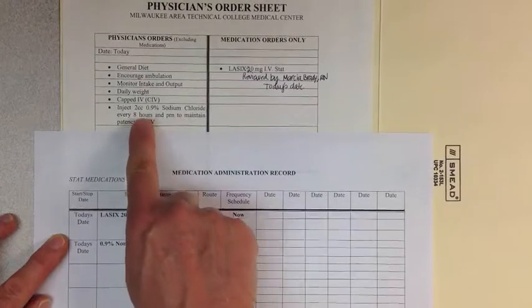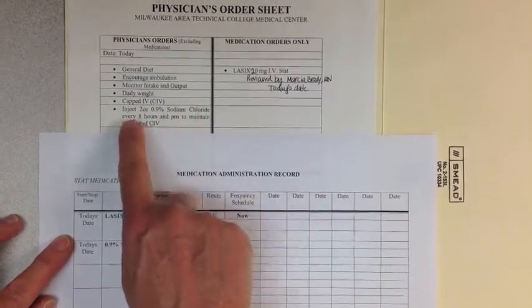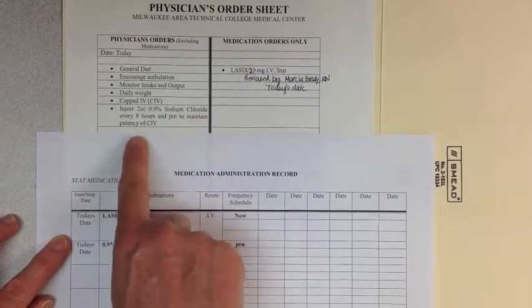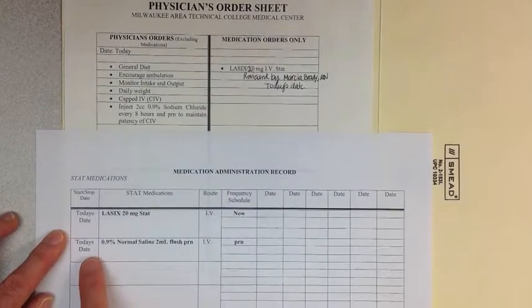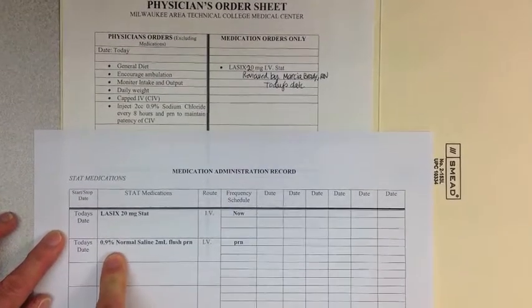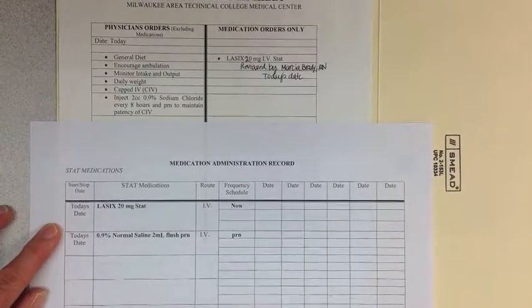I also have an order for inject 2 cc's 0.9% sodium chloride every 8 hours and PRN to maintain patency of the capped IV. And I have on the MAR today's date 0.9% normal saline, 2 mLs flush, PRN, IV.